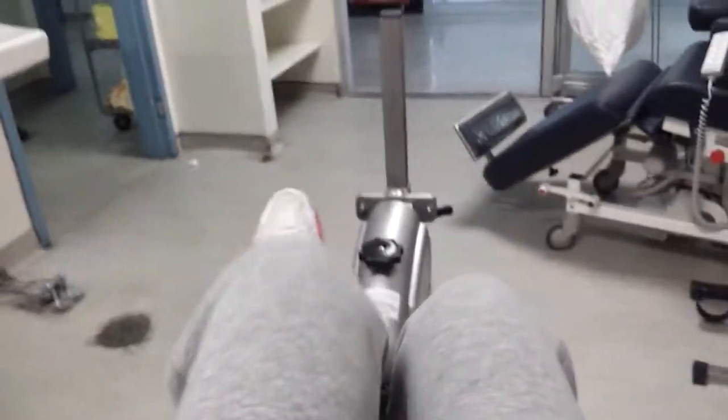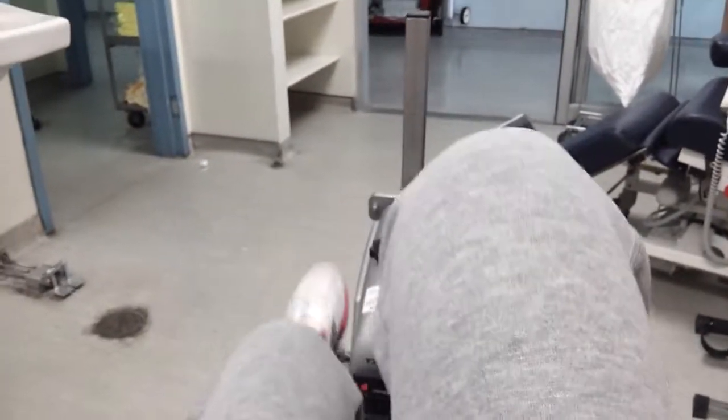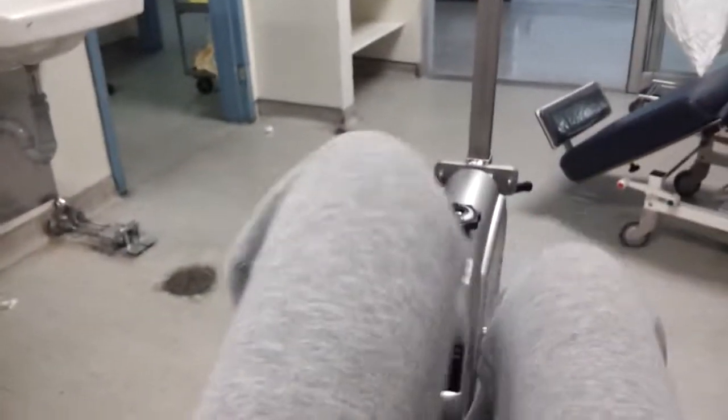Now, by pedaling right now, and I'll show you, I'm not going to overexert myself in any way by pedaling and talking at the same time. And my blood pressure and pulse is monitored on this machine, so I can check it at any point if I'm ever concerned about how I'm doing. And I also have constant check-ins with the nurse. Like, they come in and they assess what my blood pressure is and my pulse and what my levels were and how much blood was taken off, etc. So there's no worry there.